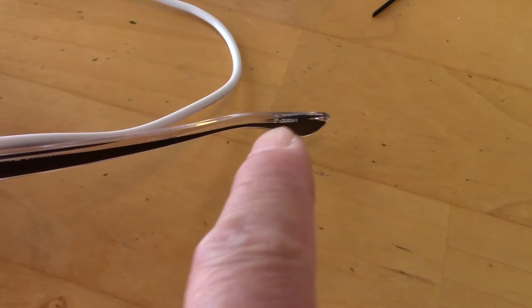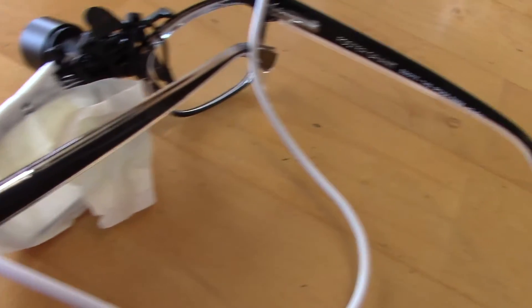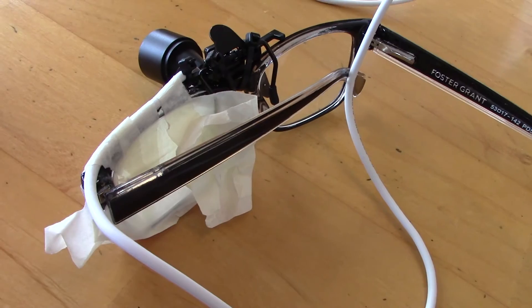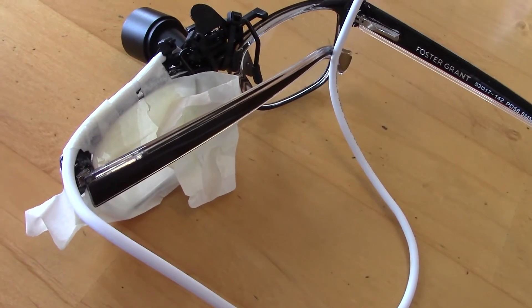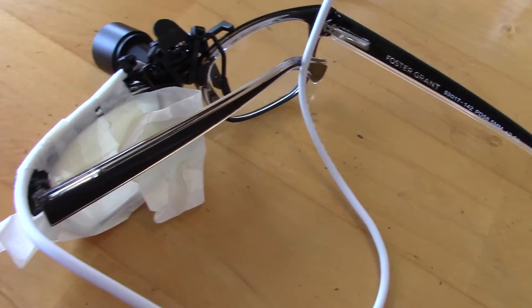The next step is to glue the wire all the way to here. Make sure you do it in a closed position so your glasses can still be folded — leave enough slack — and then you can zip tie it to the earpiece.